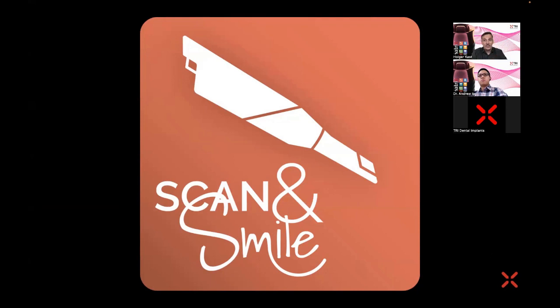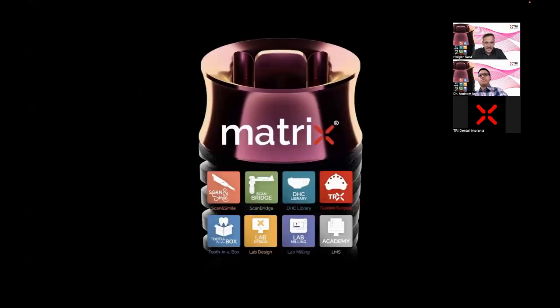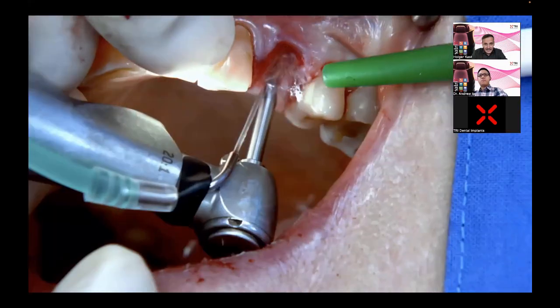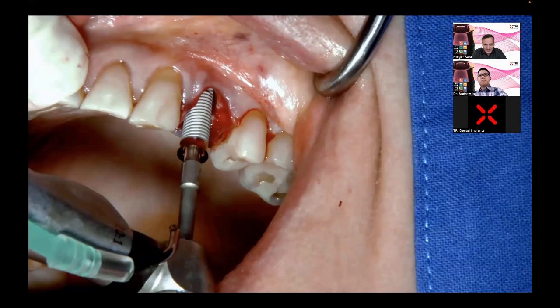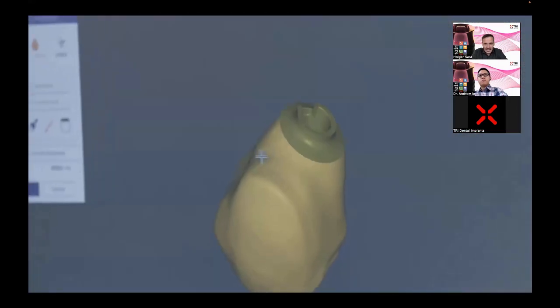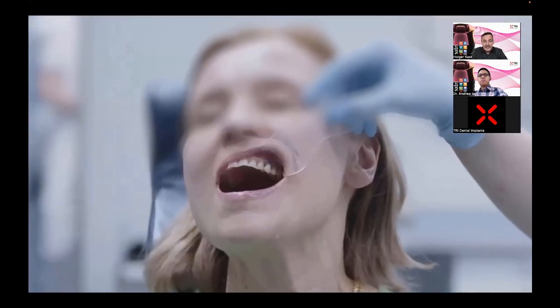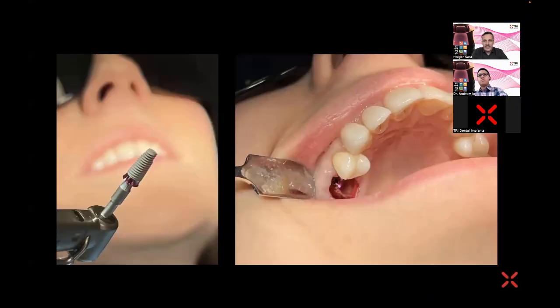And this is what you can do on a 3D printer and 3D print. Andrew again will explain this in much more detail later on, how fast you can 3D print a temporary in an immediate workflow. How fast this can go, I show you in this video. So basically, you start with placing the implant, you add the scan body, then you do an intraoral scan, you send us this scan. We make sure that this design comes to you as an STL file. You put this STL file on your 3D printer and you are ready.